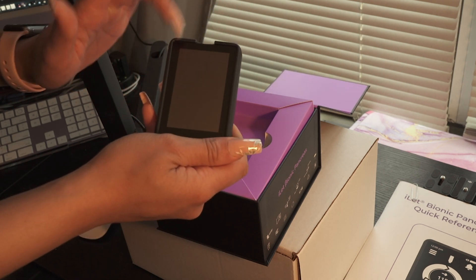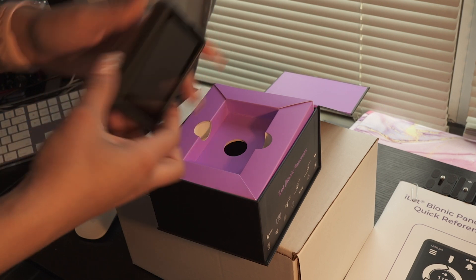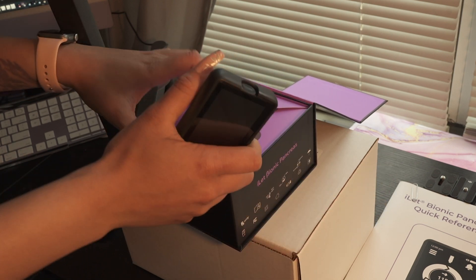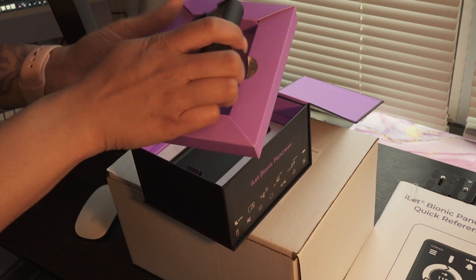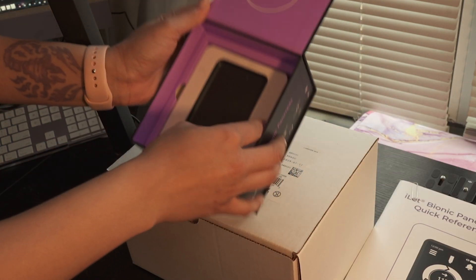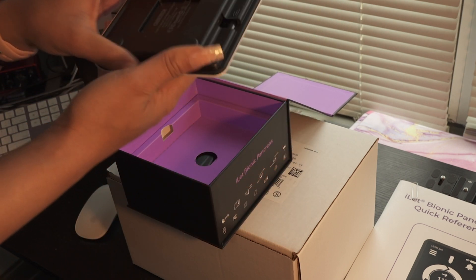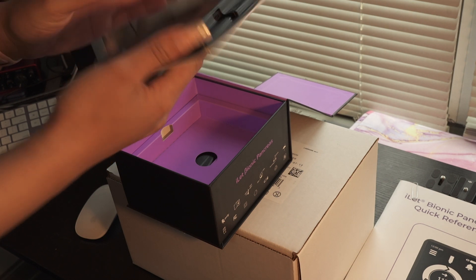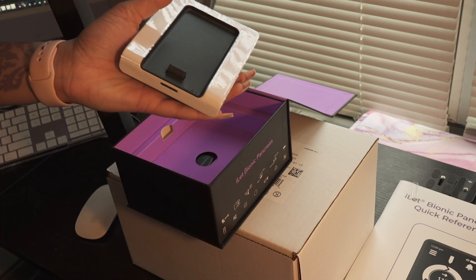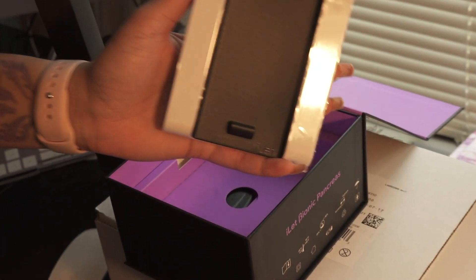It already comes with the case attached to the iLet, and right here is where you put your insulin. Excuse my nails — that's making this a little more extreme than it needs to be. We open it some more and we have what looks like the clip, and this here is the charger.